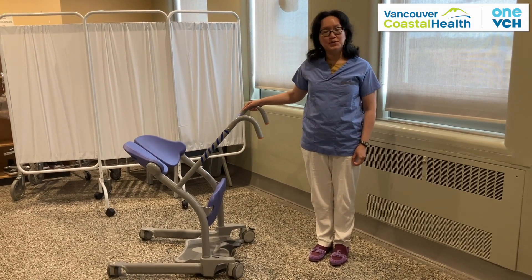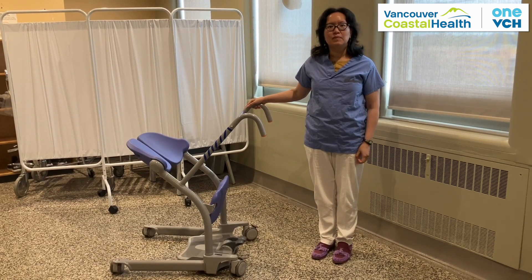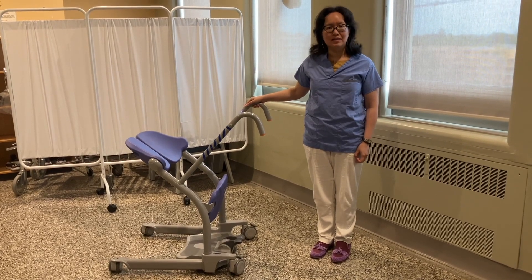Hello, this is the Sarah Steady. To use this, a patient needs to be able to follow one-step instructions. They need to be able to sit unsupported and they need to be able to pull themselves into standing with at least one arm.